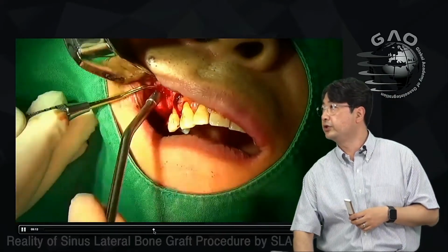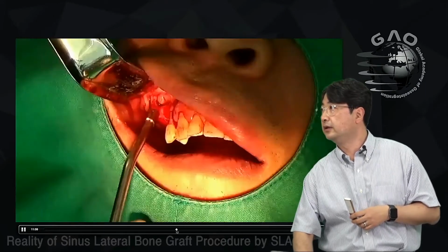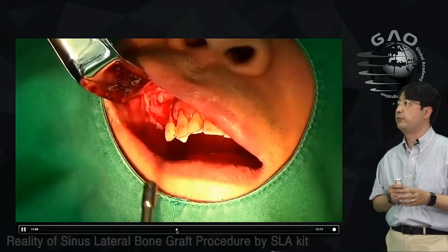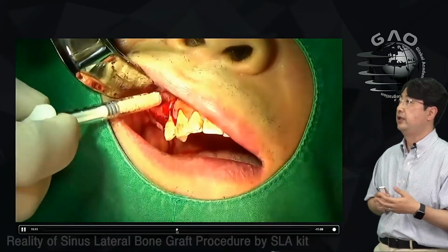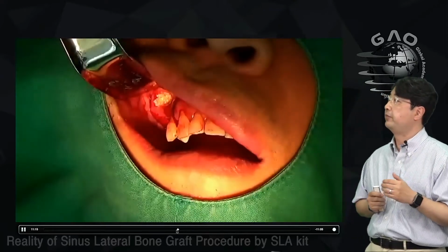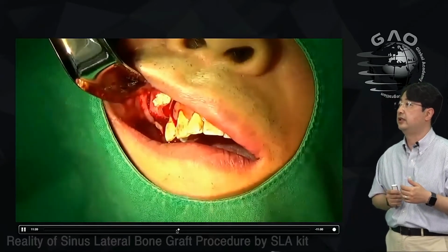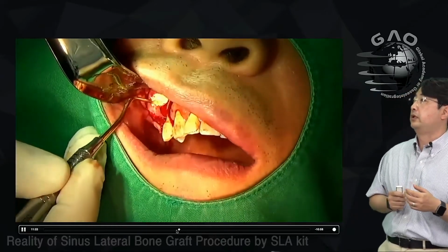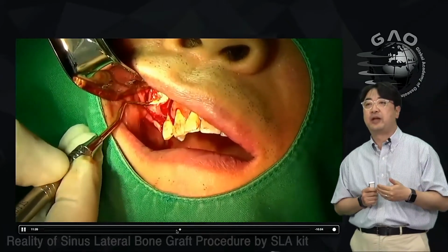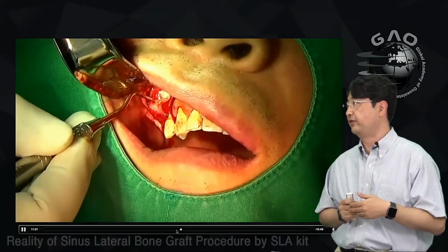So once I finish with these Freer parts, then I'm ready for the bone graft, and I found there's no perforation of the membrane, right? Then I place the bone graft in the syringe. I carry it to the site, and I'm using the Freer elevator to pack the bone underneath the membrane to the crestal area where we want to have a graft, right?